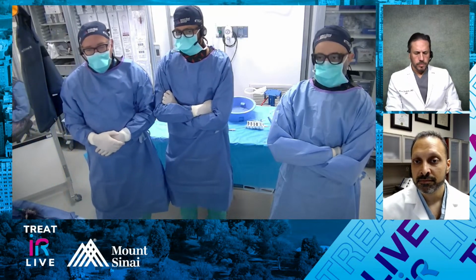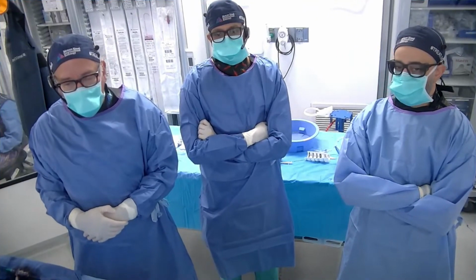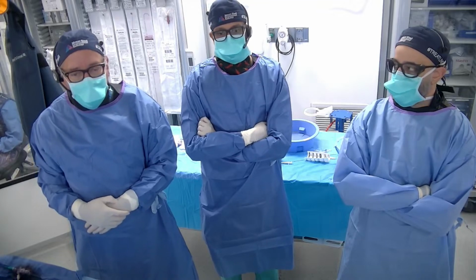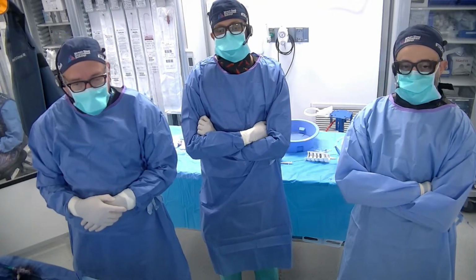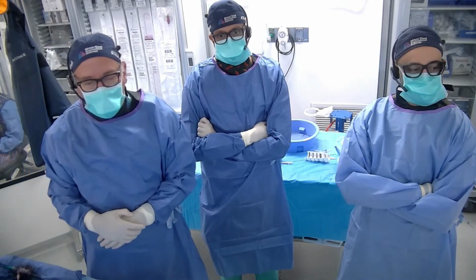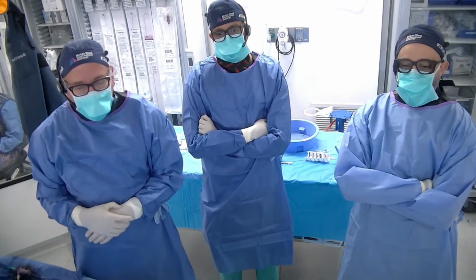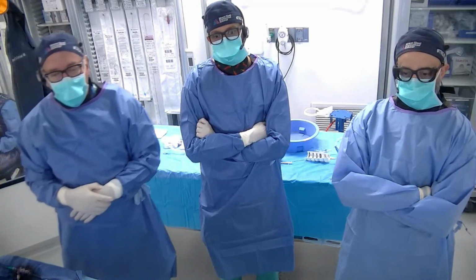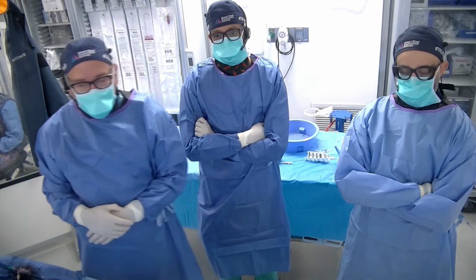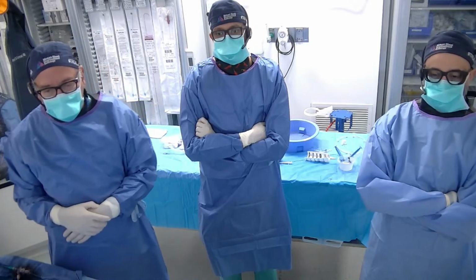Great question, and I'm going to try to introduce you to what we've done so far off camera before we went live. I guess one of the first questions I'm going to ask you is, would you address the iliacs if the patient's presenting with mild symptoms in the same setting, or would you just focus on the renals? I think that's an initial question, and then is it your practice to do, for example, one renal artery at a time, and to stage it, or to do a so-called global revascularization? I think that's a good topic for conversation.